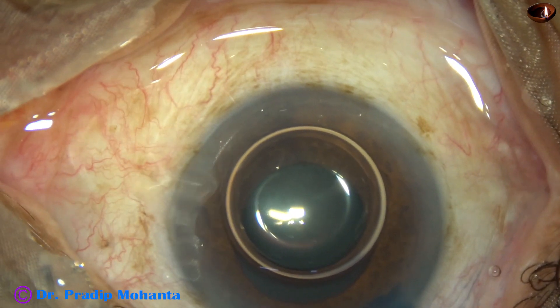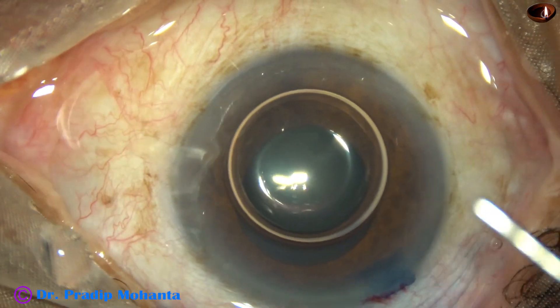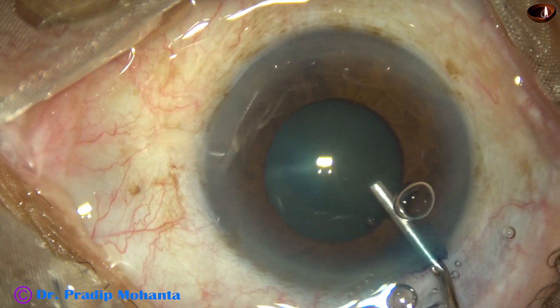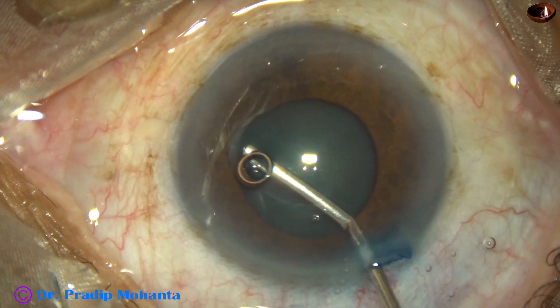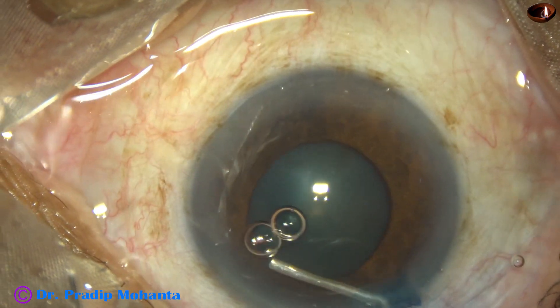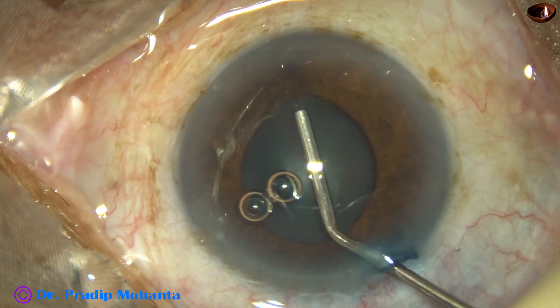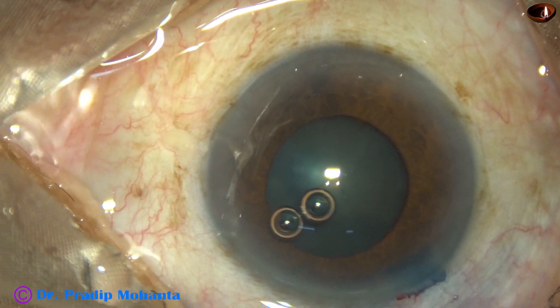And now if I try to operate with these small pupils — about 3.5 to 4 mm — there can be a lot of problems. So in this case, I have decided to apply a pupil expansion device. After application of viscoelastic substance, the size of the pupil is not enough to get an adequate sized rhexis.